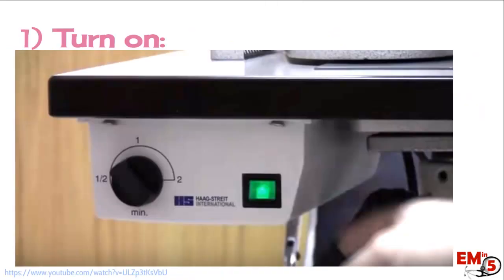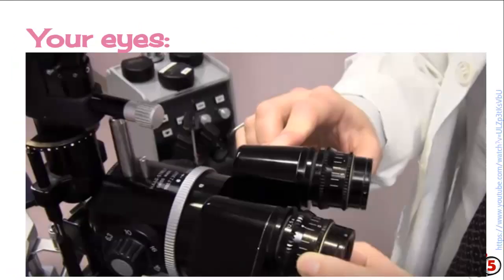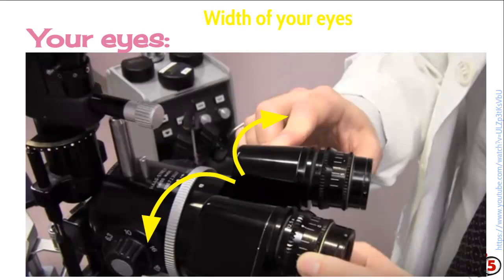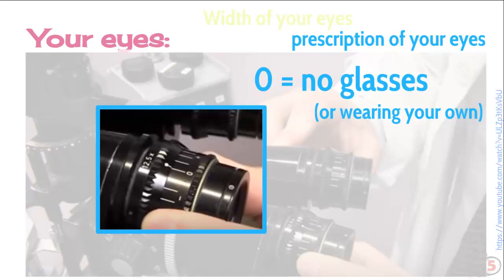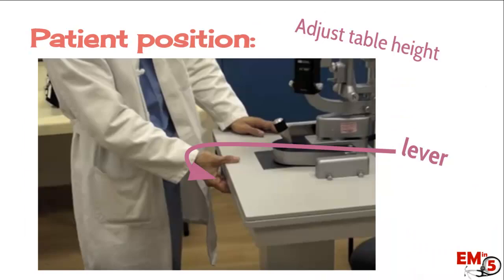First, we have to turn it on. Usually this light switch is underneath the forward part of the table that faces you. There are a couple of adjustments that you do for your own eyes as well. You can move these black pieces back and forth, kind of like a binocular, so it's comfortable for you. There are also these dials on the front which change for the prescription of your eyes. The rule here is that if you don't wear glasses, or you're currently wearing your glasses, just put it at zero.